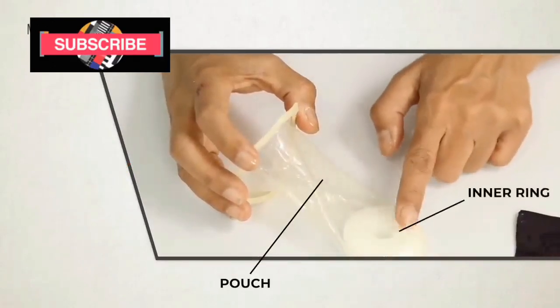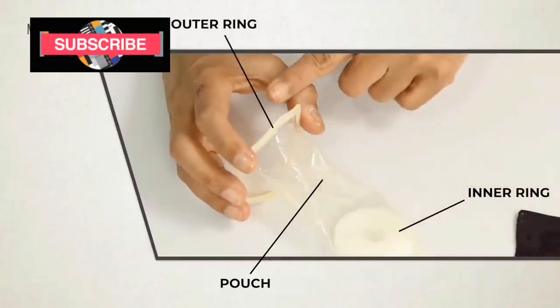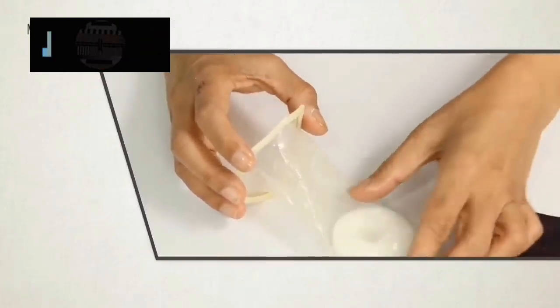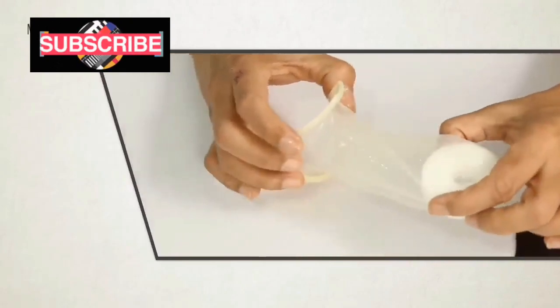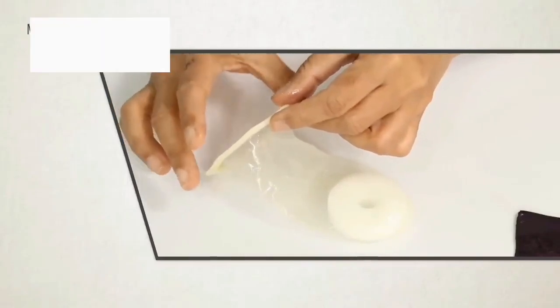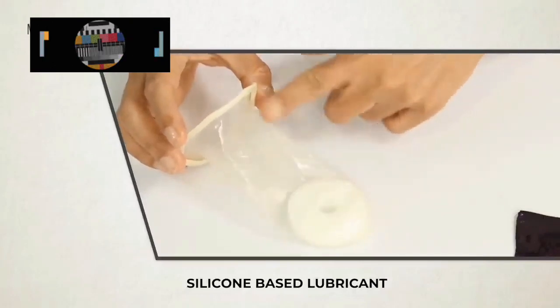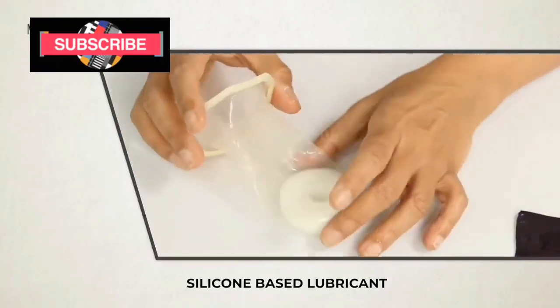This is how the interior looks like. It has 3 parts: the pouch, the inner ring, and the outer ring. The inner ring, which is the base, is used to put in the vagina and it keeps it in a proper shape. The thin outer ring remains outside, covering the vagina opening. There is also a silicone-based lubricant found on the surface and also in the inner part of the condom.